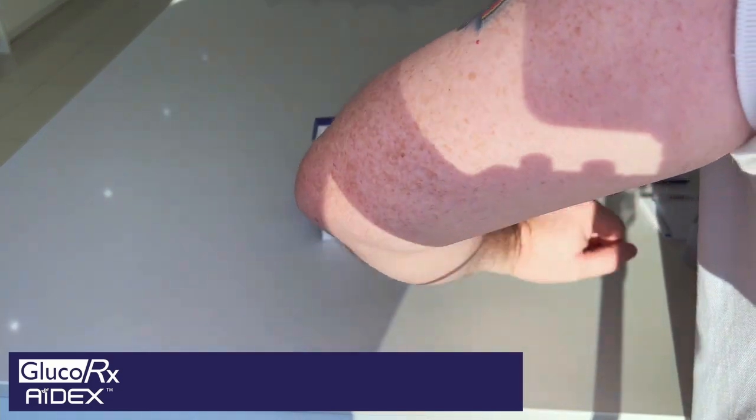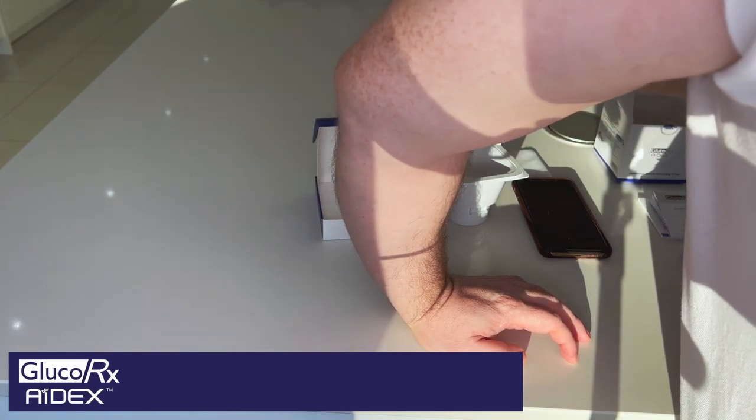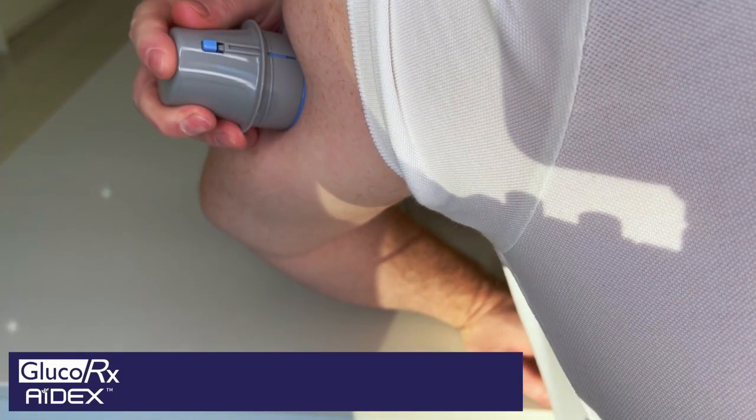Really simple — one hand, we've untwisted it, turning it anti-clockwise. You take the device and you place the device flat onto the surface, wherever you want to put it, flat onto the surface.